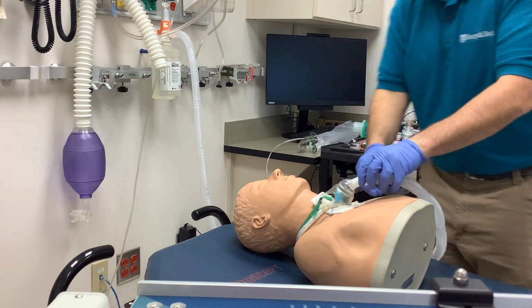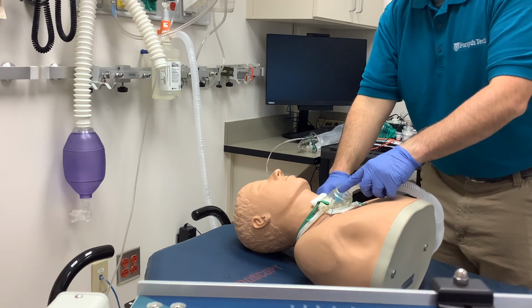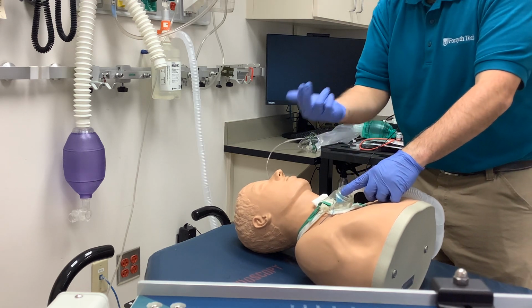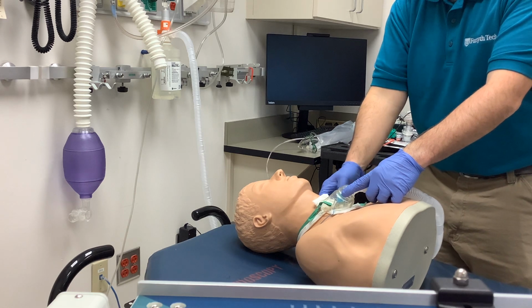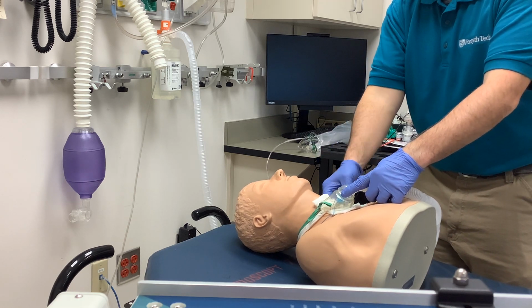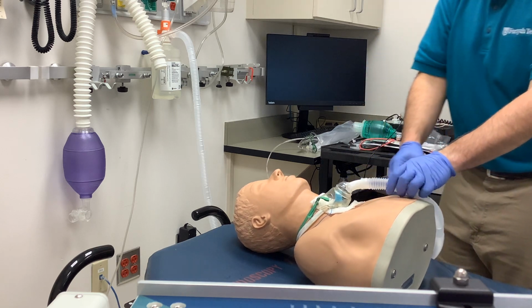ultimately inhaled by the patient. So you also want to make sure that you snug up the tracheostomy tube collar. General rule of thumb is make sure you can get 2 fingers up under it. That way it's not too tight. If you get more than that, it would be too loose. You want to make sure that you just snug it up so that it doesn't have a chance.